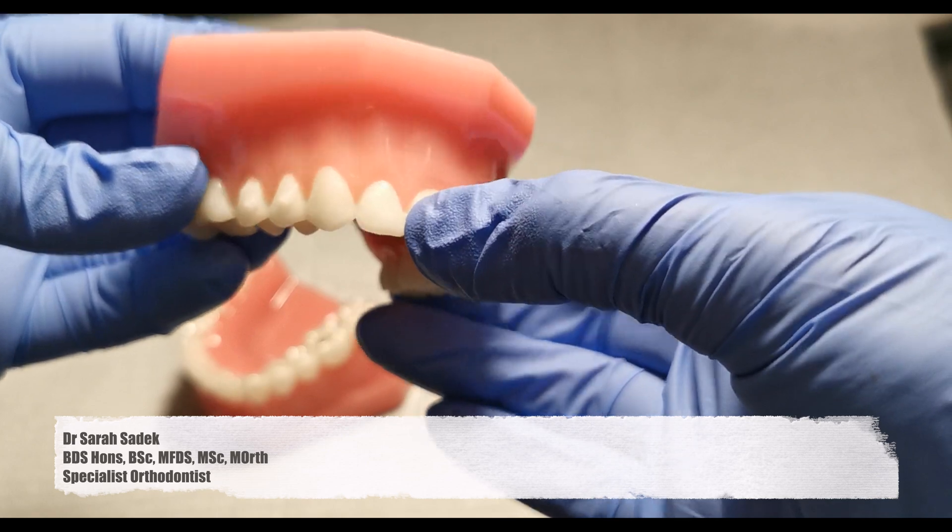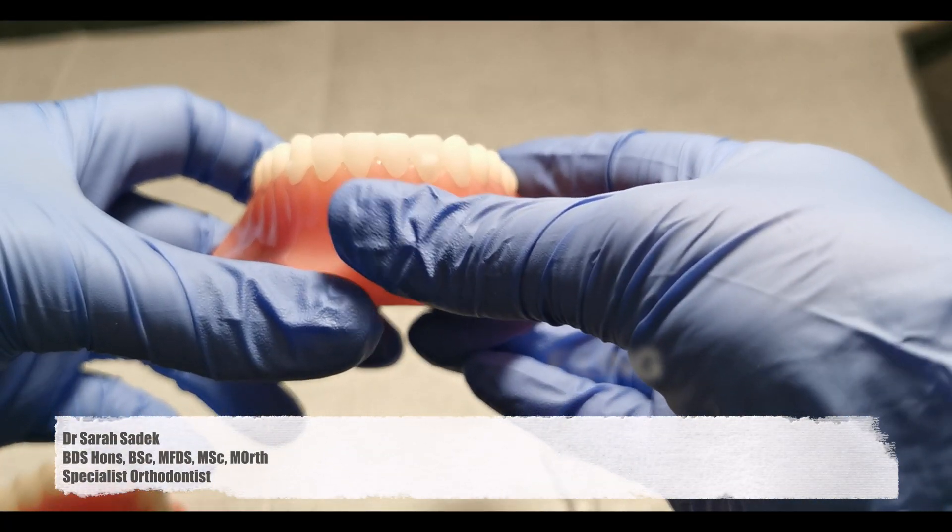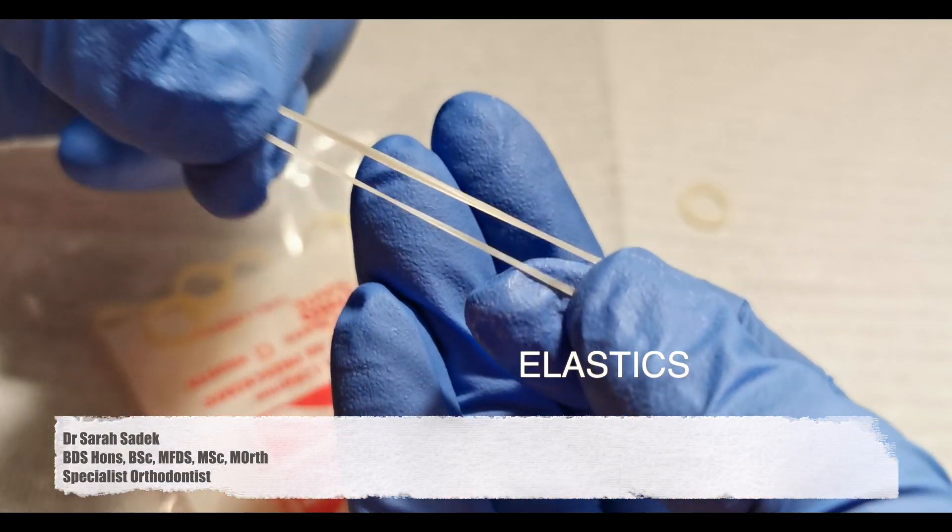Filing of your teeth may also need to be done. This involves filing between your teeth to create space — normally just a fraction of a millimetre of tooth that we need to file to recreate space. The other thing to bear in mind is that just because you're having Invisalign and not traditional train track braces, you may still need to wear elastics. Elastics are used to improve your bite.